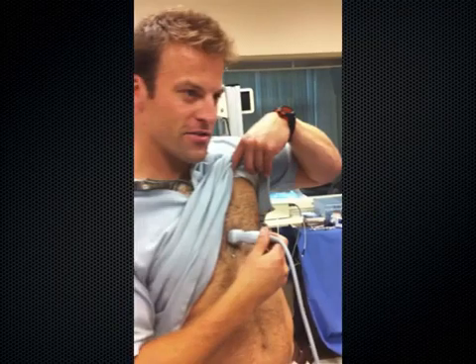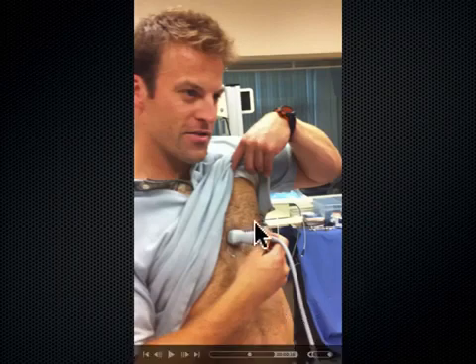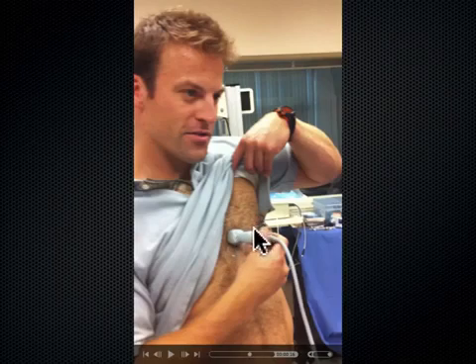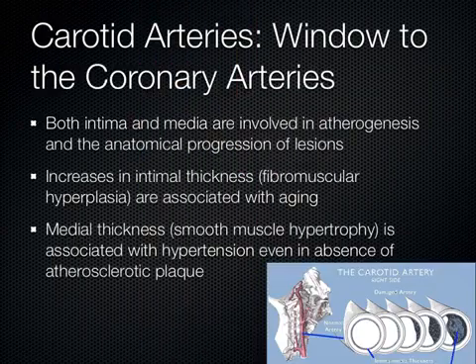So that's Eric Mervis. He's one of our residents in the emergency department, and when I first saw him do this, I thought, wow, does he just have really wide spaced nipples? Because look how far apart the probe is from his nipple. But he doesn't. I looked for a web neck. It's because he's standing up, and the heart shifted in his chest cavity a little more medially. This is why when we do this on patients, we lay them flat and roll them left lateral decubitus, and that makes the PMI somewhere over here. That's where he'd be putting the probe. But I just wanted to point this out. He's a really good sport about stuff like that, so I'm sure he wouldn't mind that I stuck that up there. Any questions about that kind of stuff?